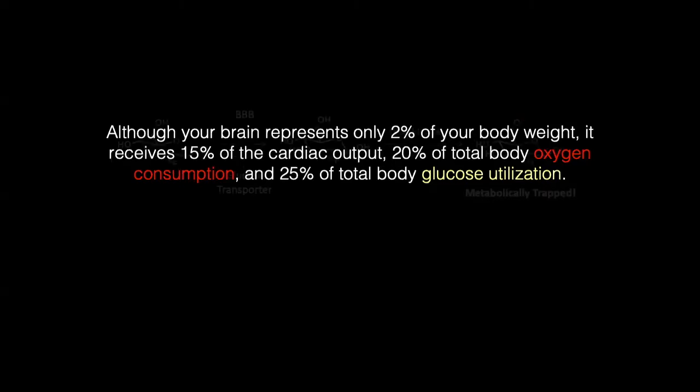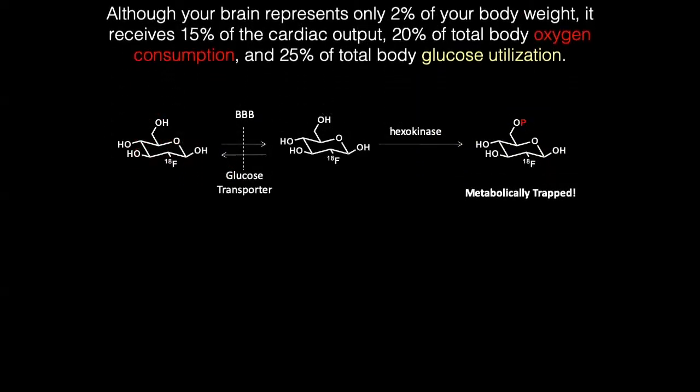And in FDG, what you're looking at is really, so this on the left is your FDG tracer. It crosses the blood-brain barrier and then interacts with this enzyme hexokinase. And when it's modified, it becomes trapped in the cell and is really metabolically trapped. That's how you can measure an increase in glucose utilization, because the chemical structure has changed due to the interaction with the enzyme.